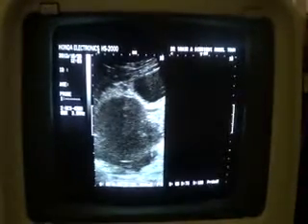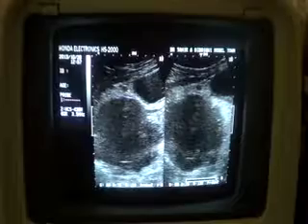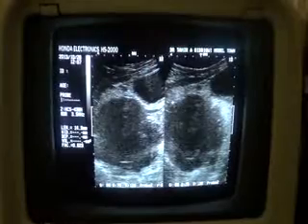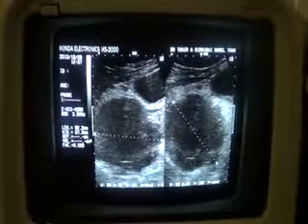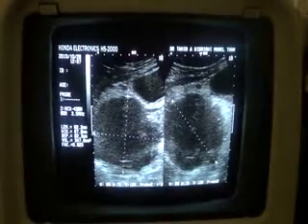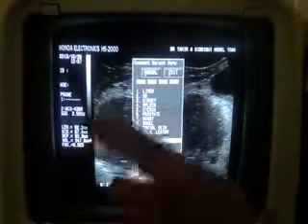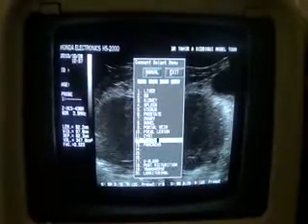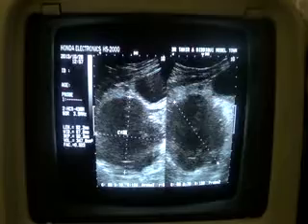This is the one in the right adnexal, and its volume is approximately, this is the longitudinal section, this is the transverse section, so you can see that it gives 347 ml of fluid present in this cyst in the region of the right adnexal.